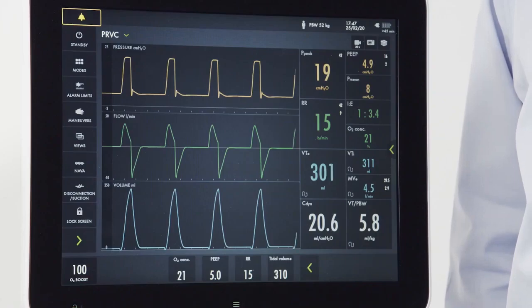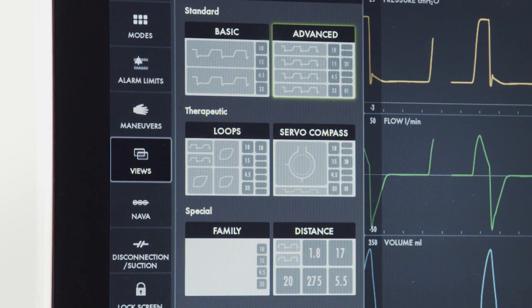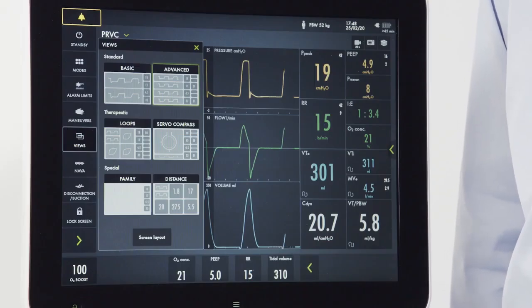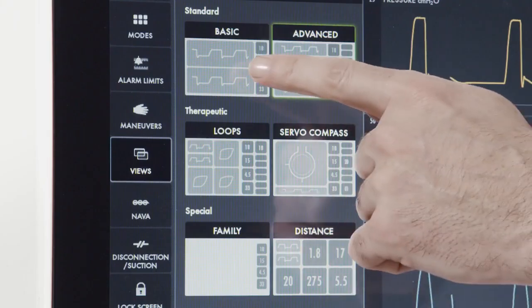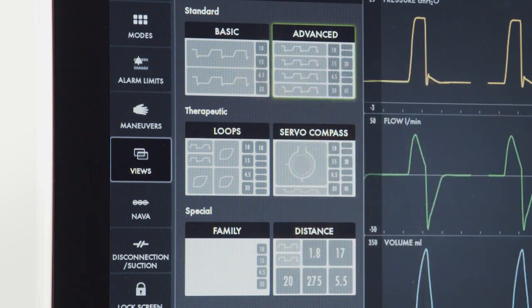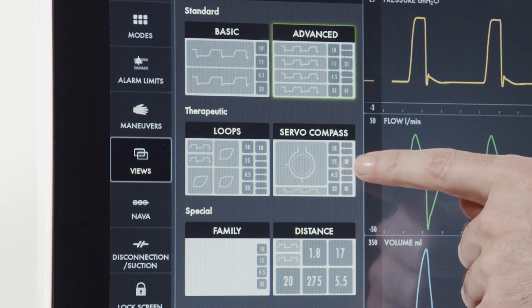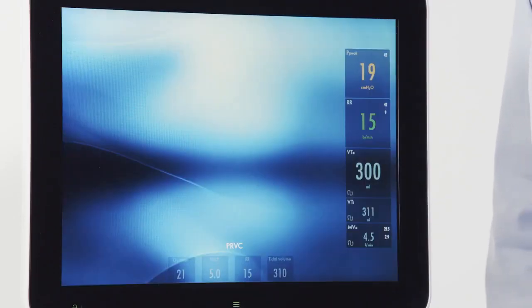There are six different views on the Servo-U ventilator. When I press the view screen, I can see all six depicted. We've spent most of our time in advanced view, which has two rows of patient measurements. Basic view has one row displayed. There are also views for loops and the Servo-Compass.